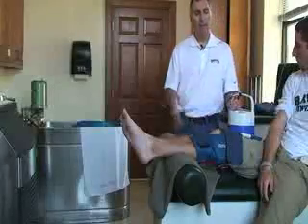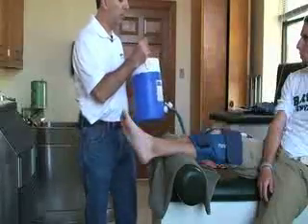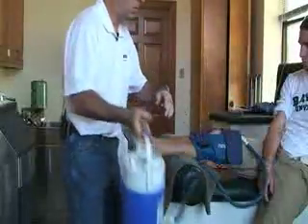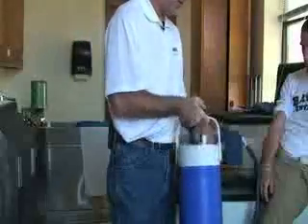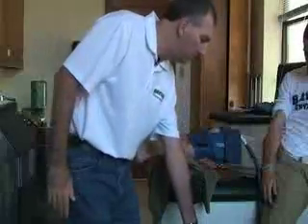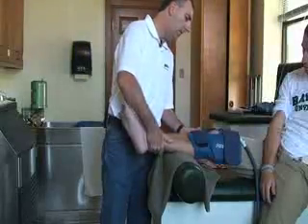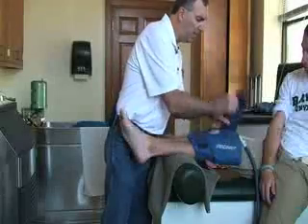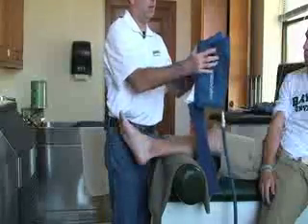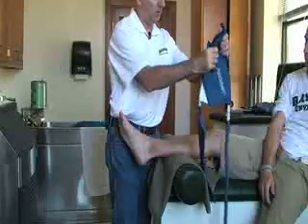At the end of the 20 minutes, to drain the water out, open the air vent and lower the bucket so the water flows back out of the attachment and into the cooler. To speed it up, you can take the attachment off and squeeze the remaining water out.